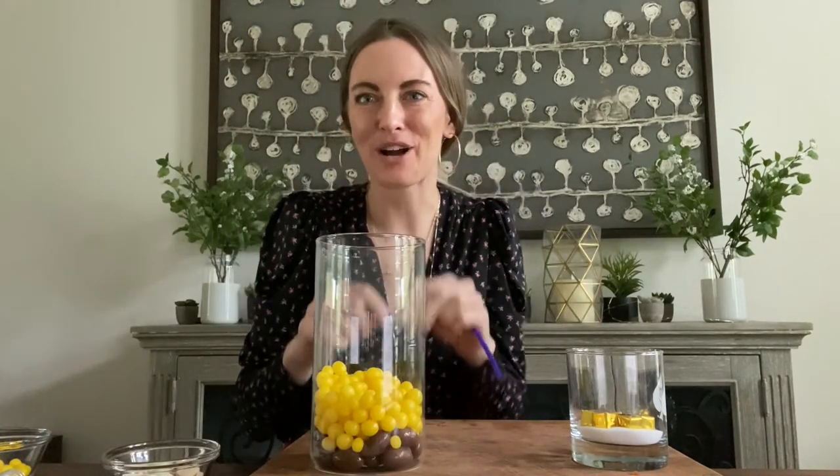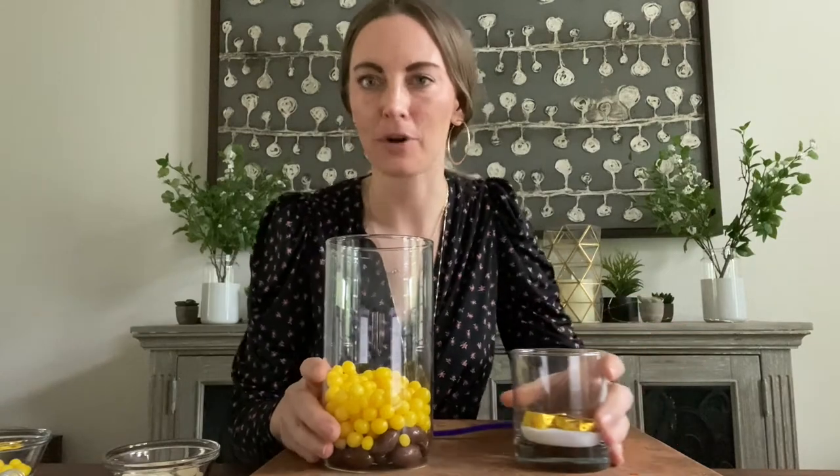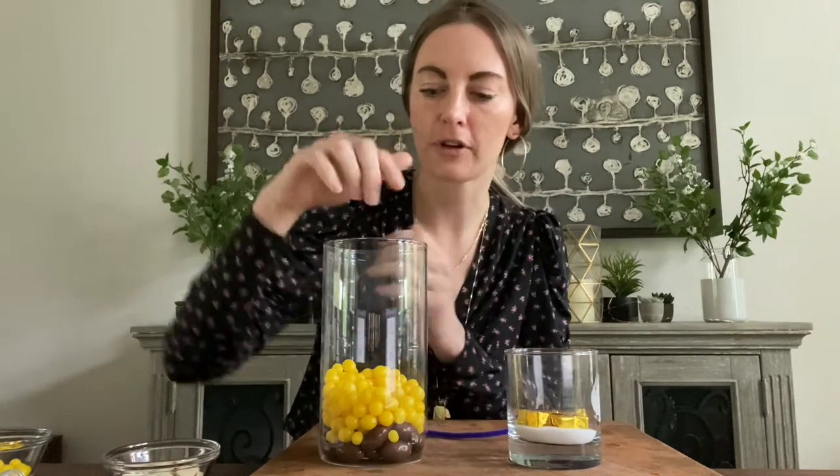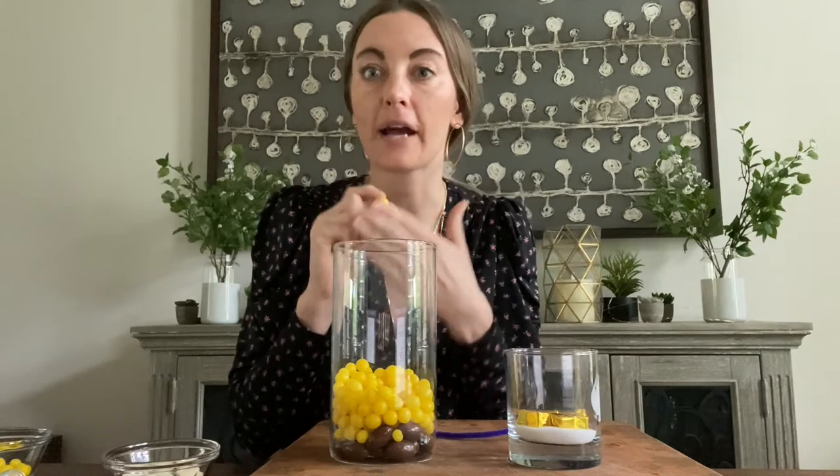Now we're going to do the fun part — we're going to talk about the water softener and how it works. Your water softener works through ion exchange and there are two main parts. You have a brine tank. Brine is a fancy word for a solution that has a high concentration of salt, so your brine tank is a big bucket of salt with some water in it. The second part of your water softener is the resin tank, which is filled with resin beads.